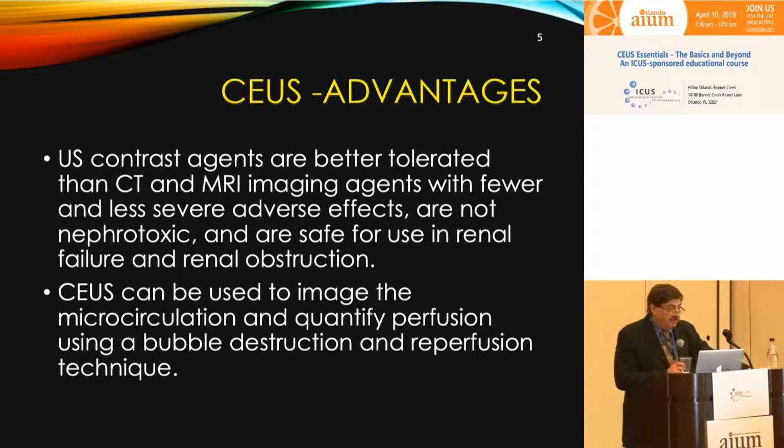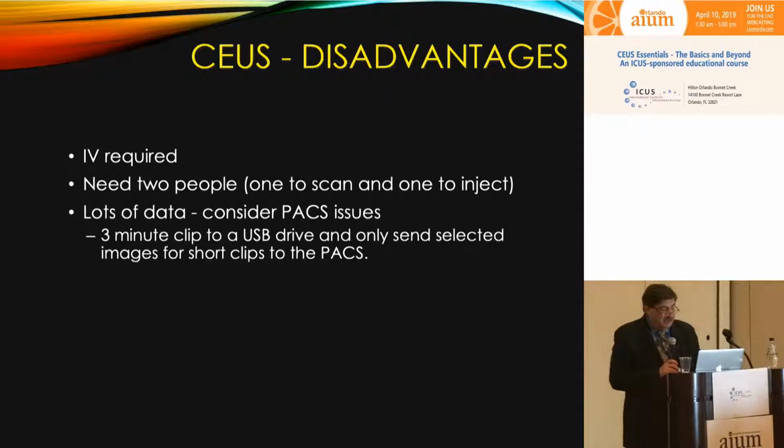These agents are better tolerated than CT and MRI with fewer and less severe adverse effects and are not nephrotoxic, and are safe for use in renal failure and renal obstruction. And we can use this to look at the microcirculation and quantify perfusion using a bubble destruction and reperfusion technique.